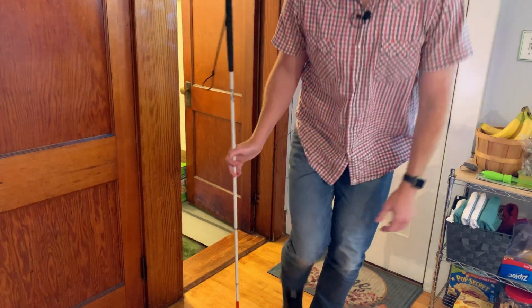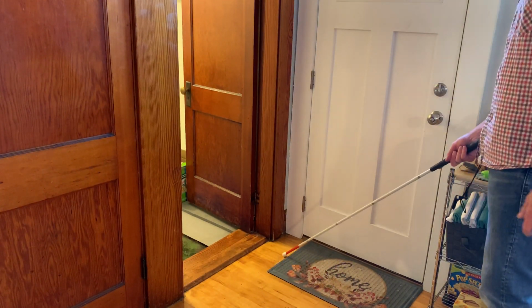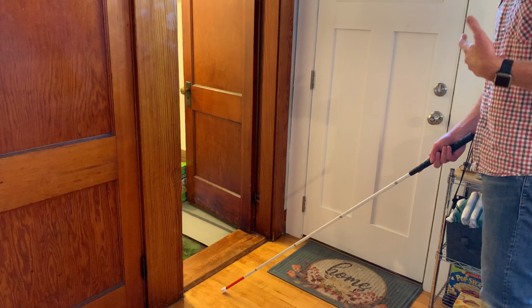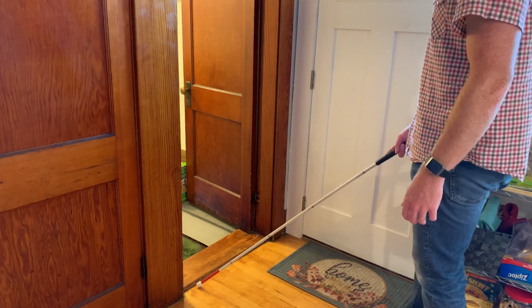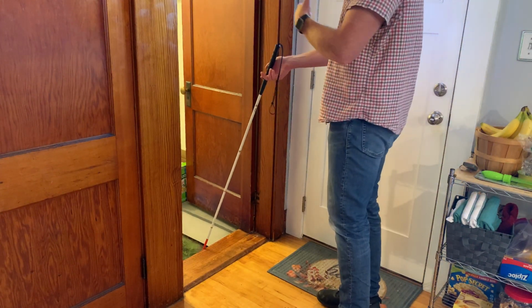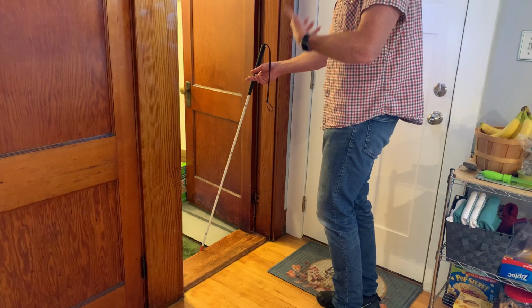I'm going to demonstrate here using constant contact. I'm approaching the stairs using constant contact, and I'm waiting to feel my cane drop over the edge of that first step. Right now I am heading towards the top stair, moving my cane left and right in constant contact, and just there I felt my cane tip drop over the edge of that top stair. That's really important. That's the cue that you're coming up to the stairs.